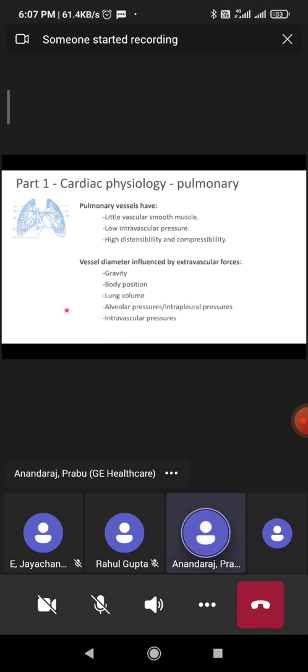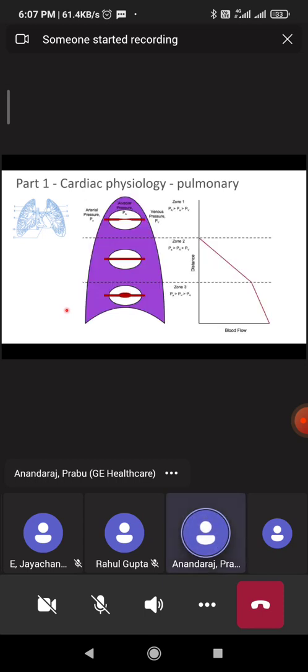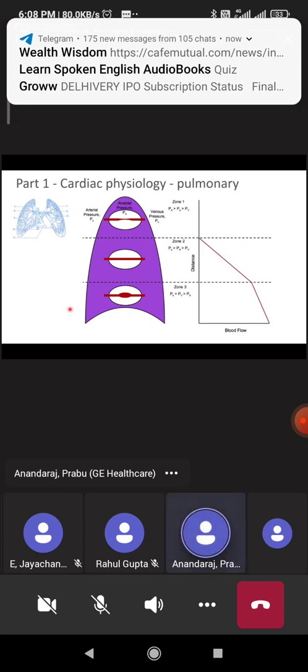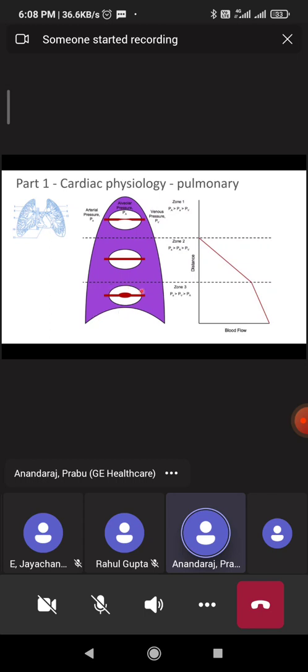Okay, so why am I talking about these things? Now, shift the gear and come to the lung. What happens when the pulmonary circulation, which is a part of the heart, how is this related to gas exchange? Now, I was saying that because of gravity, there will be a lot of blood in this region and less blood here. If I'm treating the lung as a single unit, and let's say I'm putting a pressure of 25 centimeters of water in the ventilator, do you think that the 25 centimeters will be evenly distributed throughout the lung?